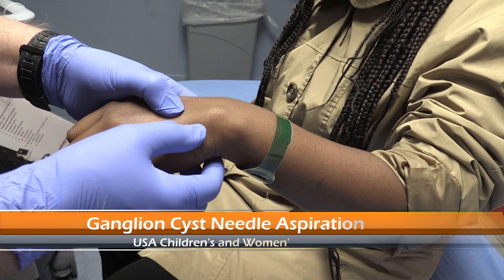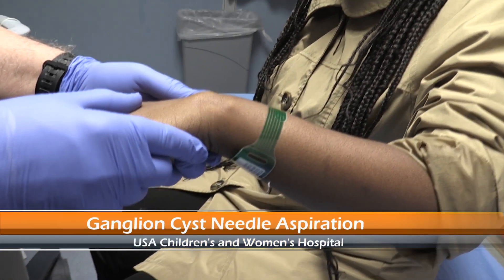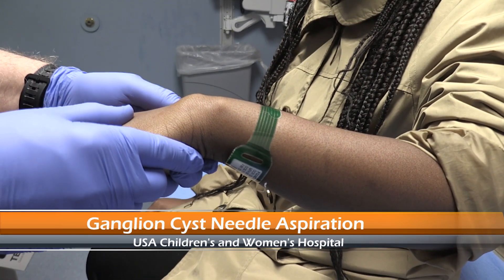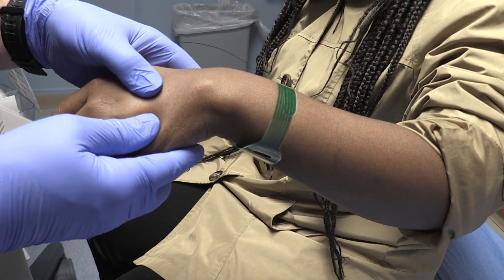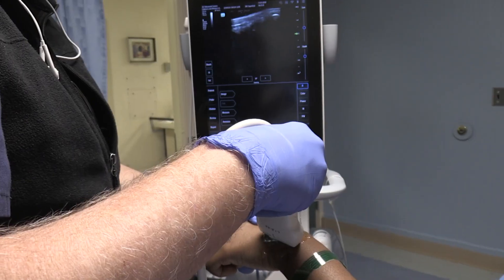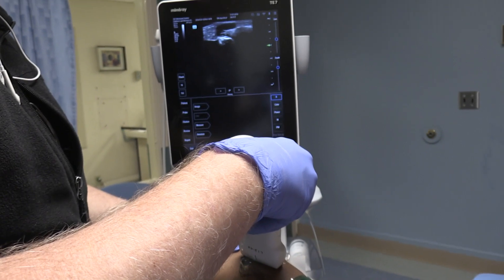Right here is this ganglion cyst. I'm going to turn the arm this way a little bit — there we go — kind of shows it popping up. Then bring the hand back this way. There's a real nice view on that. We're doing the ultrasound here, and lo and behold, see the screen there.